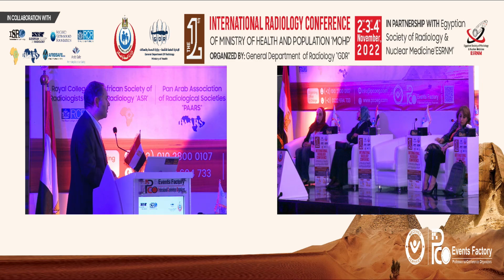Other cases, like the double contrast barium studies we used to do a lot for the stomach and colon: now it's a question and answer, like whether there is a leak in patients with bariatric surgery or gastric bypass, and for the colon, for colostomy, whether there is a leak or a stricture. In the past few years I haven't seen any of those double contrast studies.